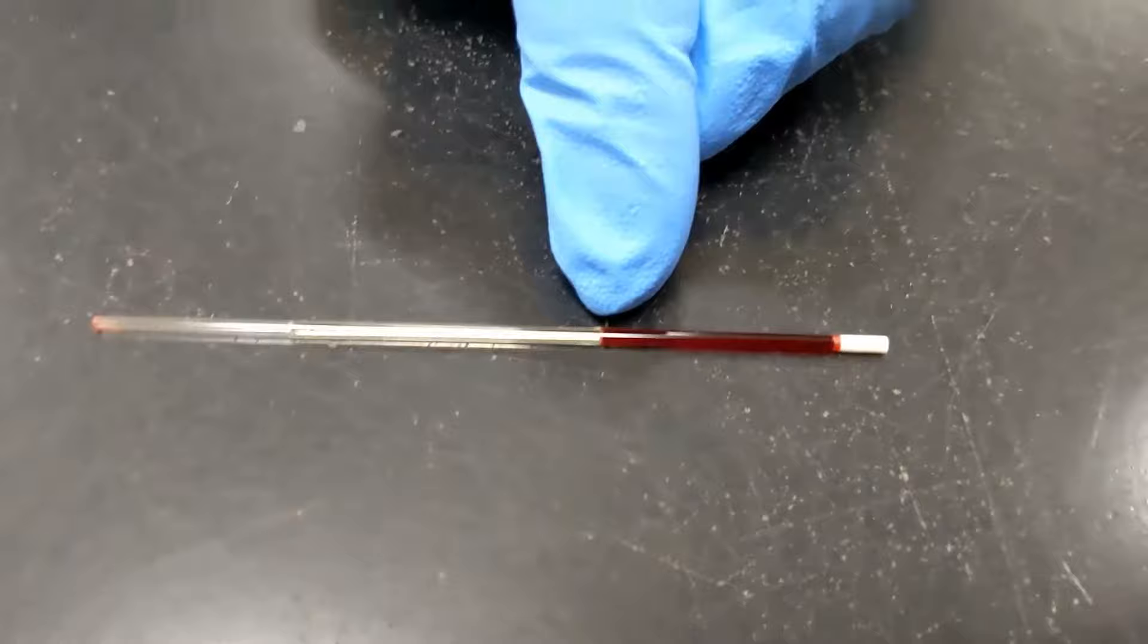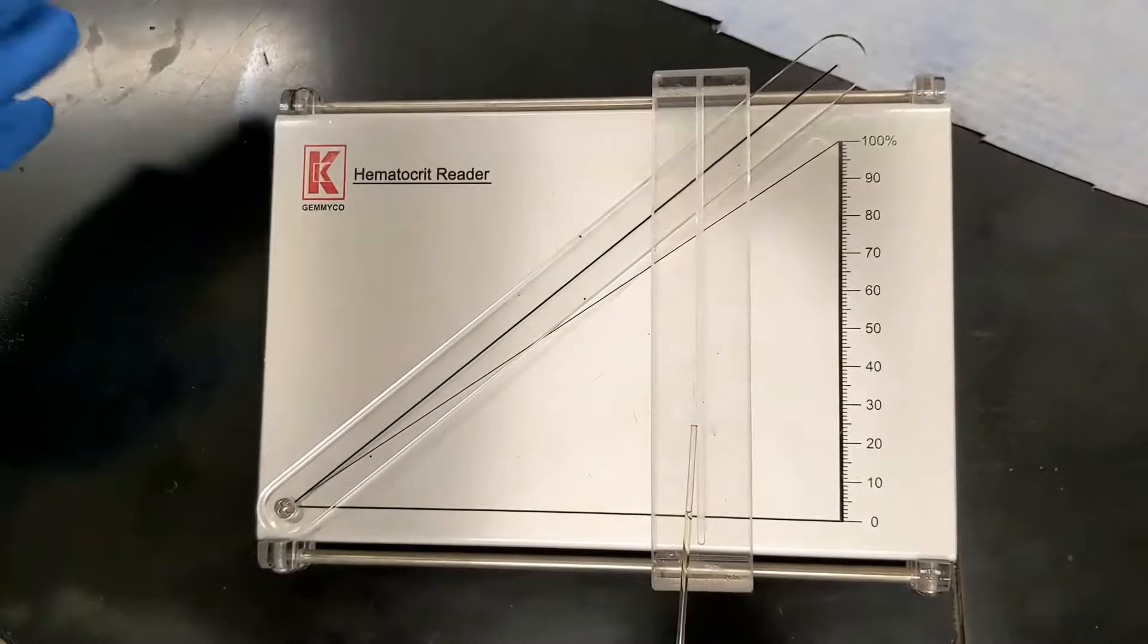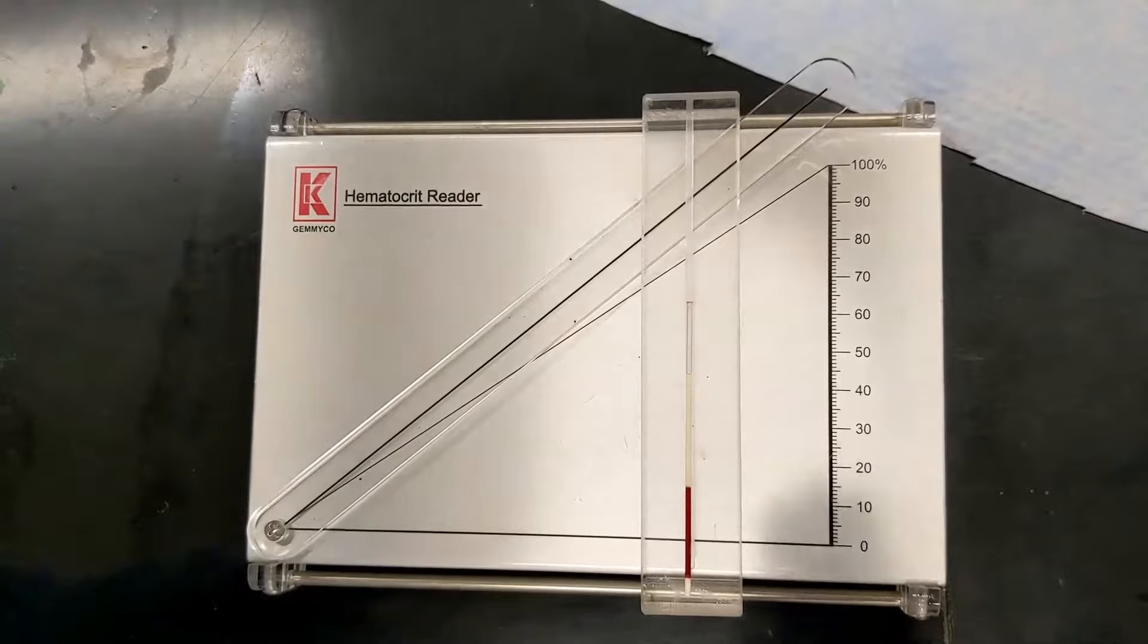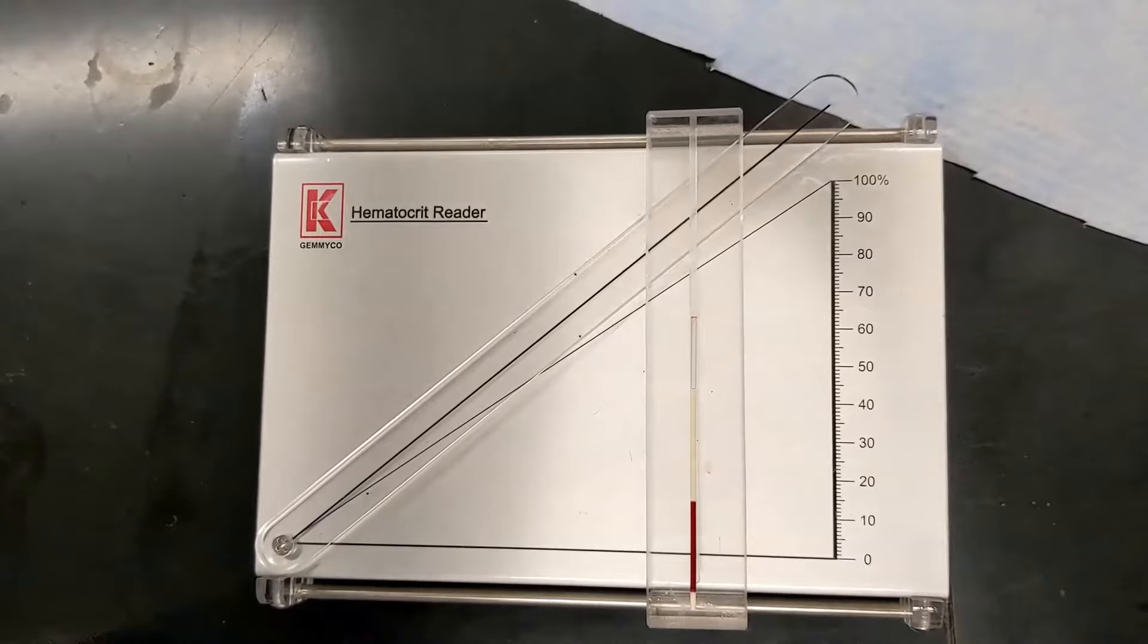This is the hematocrit reader. You'll see a lot of these in hospitals because it's easier than using a ruler and measuring total blood versus the amount of red blood cells or erythrocytes. You'll be doing that with your instructor as well, but here's how you use the reader.